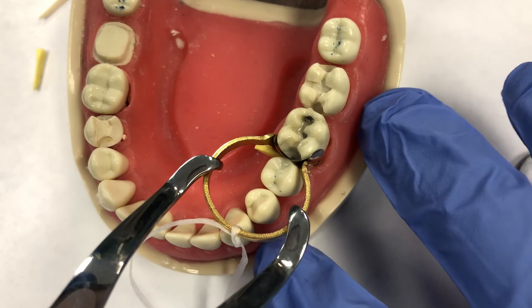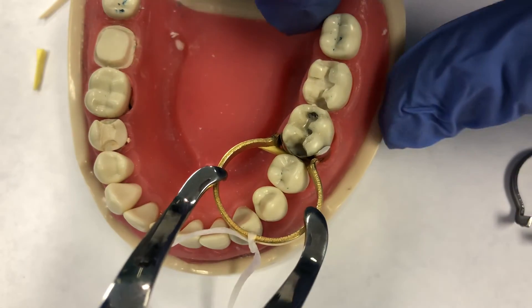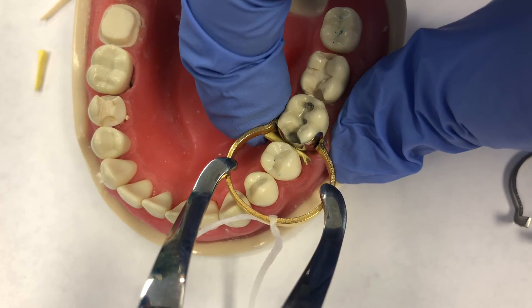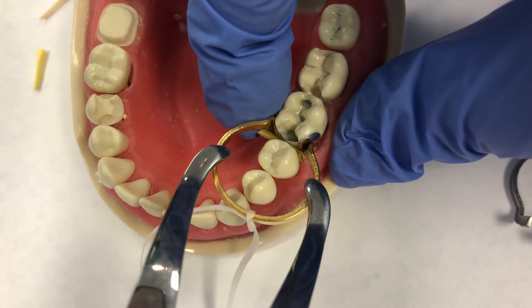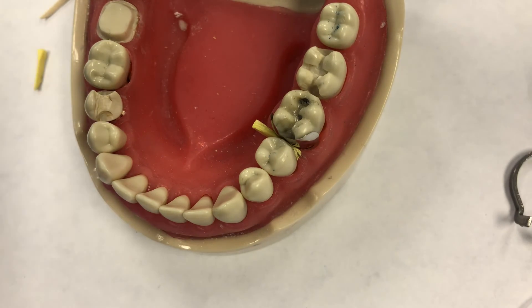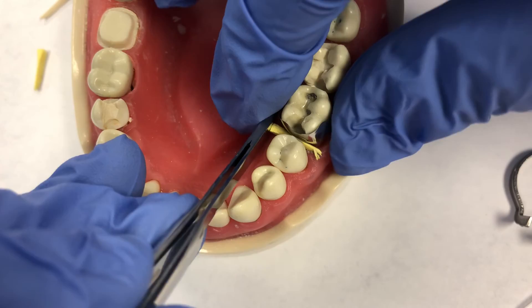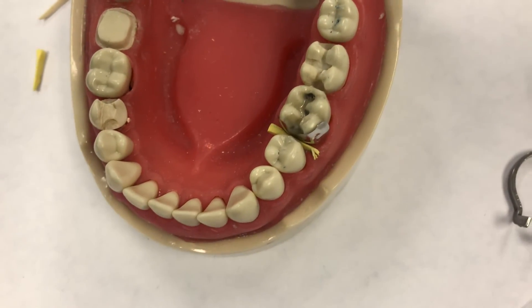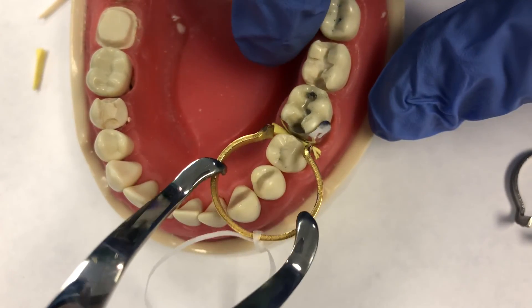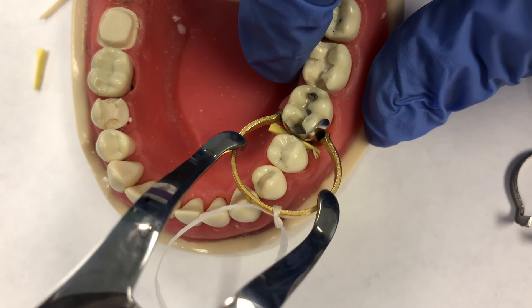This is one of the more challenging systems to use, though there are really nice ones out there. If you find that it doesn't like to stay in place, it's often because the wedge is not in all the way. You can try to insert the wedge a little further so that the ring has something to rest on when it goes into the interproximal side. This particular manufacturer says you don't really need a wedge if you're using a flowable composite, but a lot of doctors like to use a wedge no matter what.